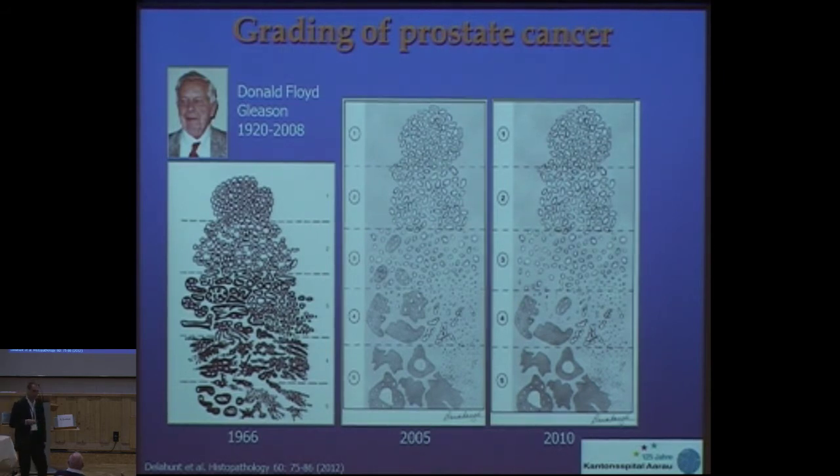the first attempts were made, but as you see, there was not much. You know, we were talking at that point about the cribriform lesions that were included here, which are mostly diagnosed as Gleason 4 right now, but in the former versions were included in pattern 3, and that was the reason in the early days we were all low graders. So you always had these 2+2, 2+3, 3+2, and you rarely had those high-grade tumors.